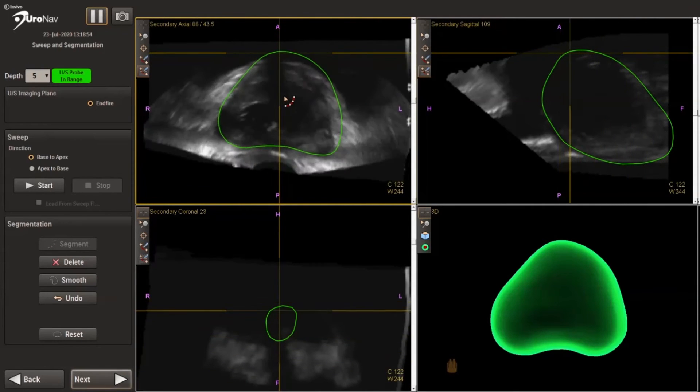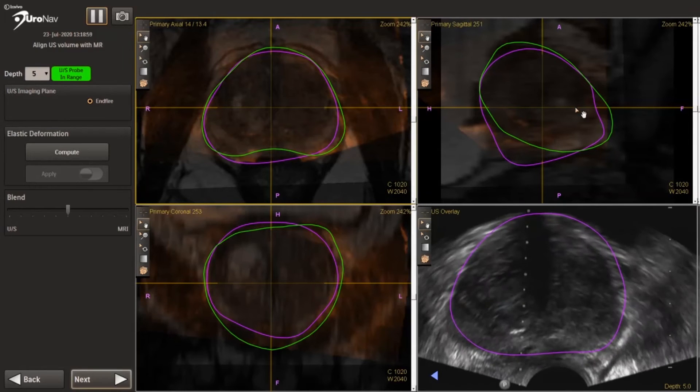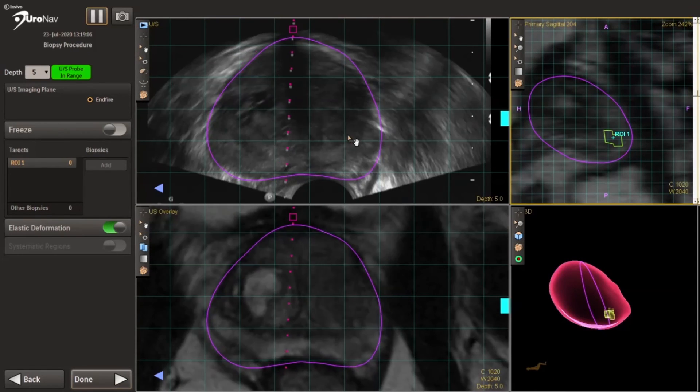We do have the elastic deformation function that allows tighter registration of the ultrasound to the MRI.